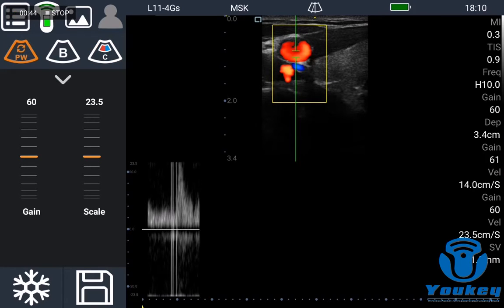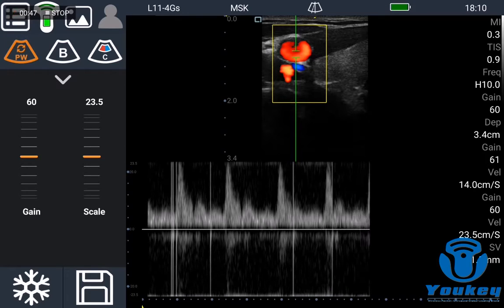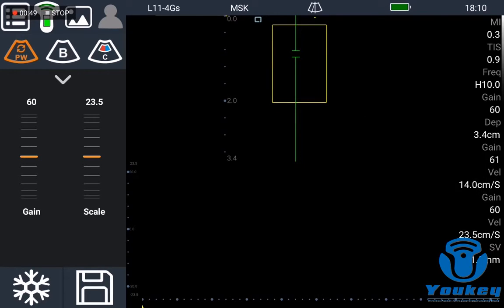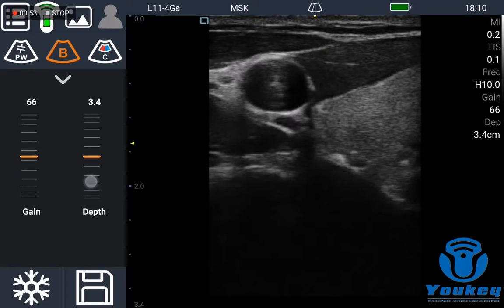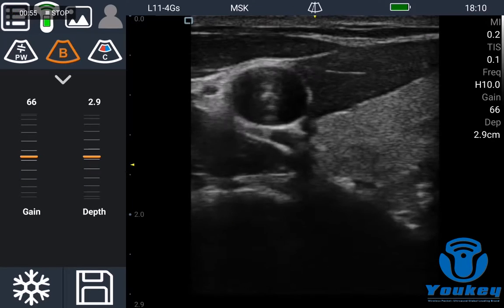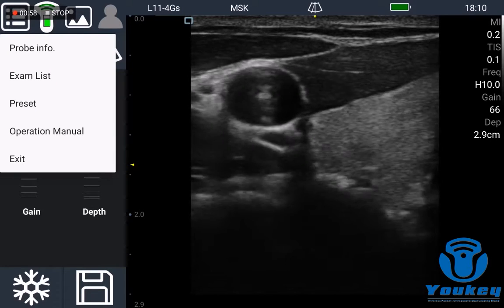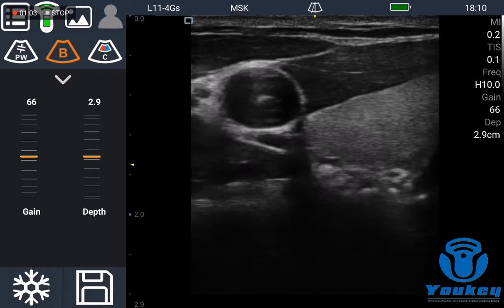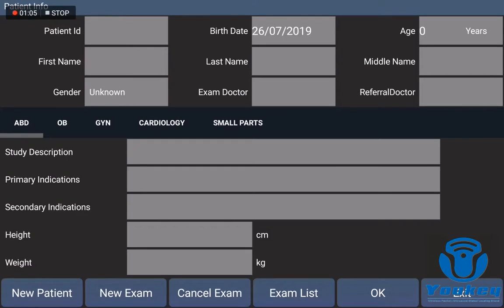Then it updates to get the spectrum of the images. You can change the gain and depth like this, and the other settings including the probe information. You can check the other details after you have the unit.